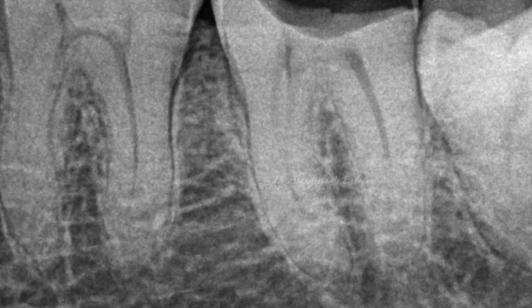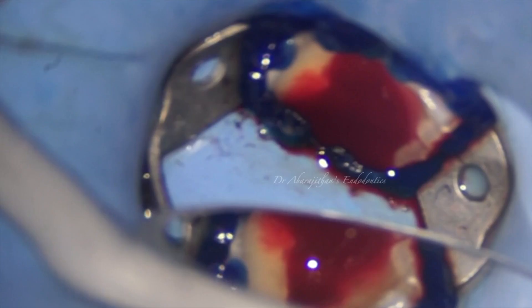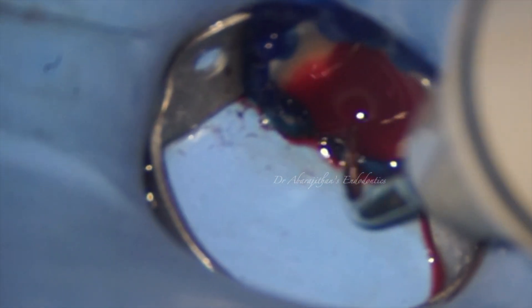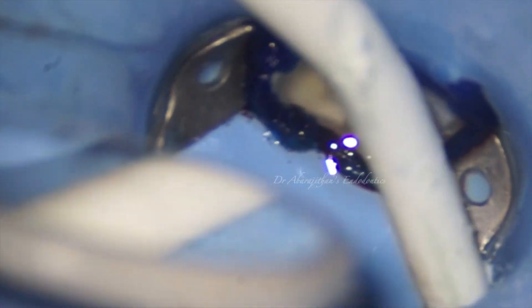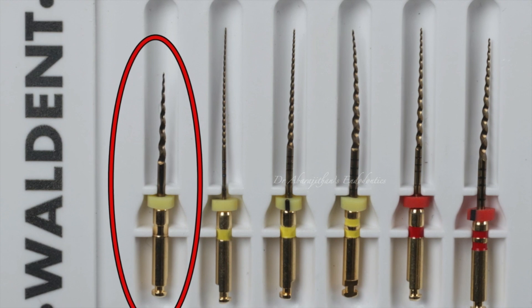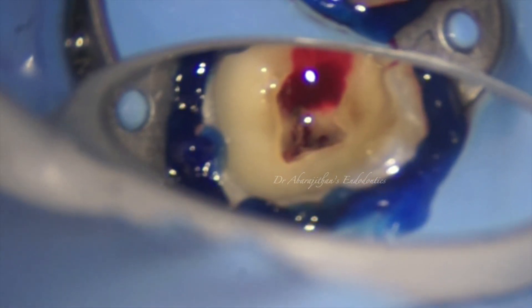Case number three is the third use of the same files, and this was a pretty tough tooth for the files to be evaluated. You can see the pulp chamber is nicely constricted and the canals are curved — there is no patency visible in the distal canal beyond the middle third. Upon initial access this was a case with acute pulpitis — you can see the amount of bleeding. Ultrasonics are used to wash off the coronal pulp tissue, and the same instrument sequence is followed as per the manufacturer's recommendation without skipping any file.